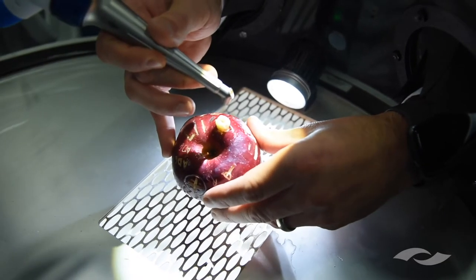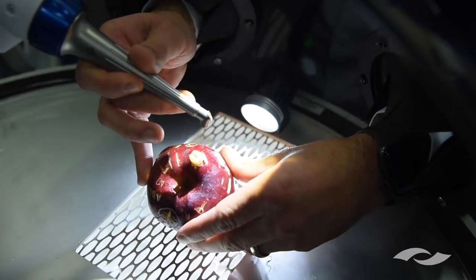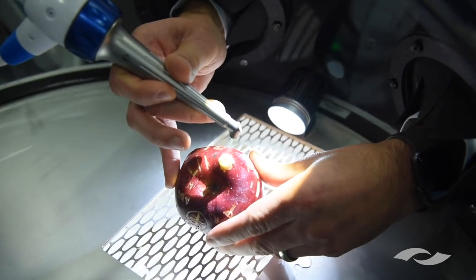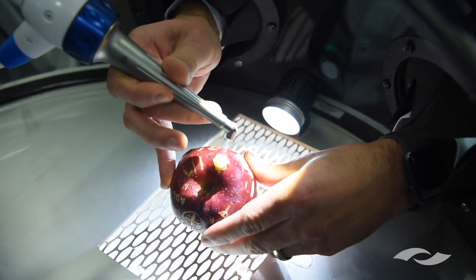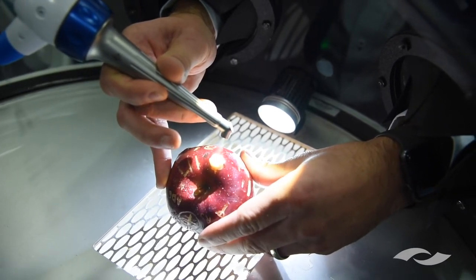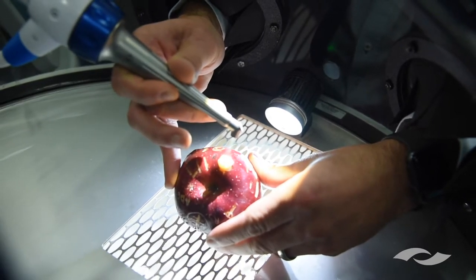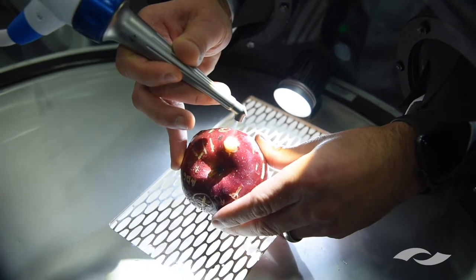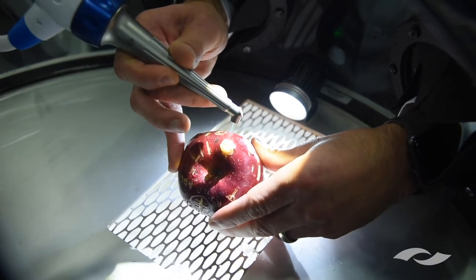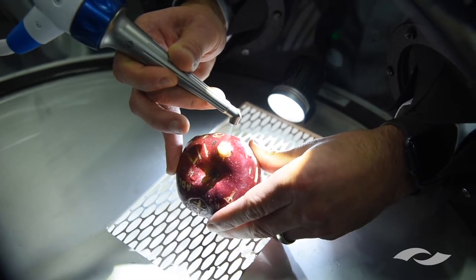When we cut a prep, we approach it a little differently than we do with a bur. We give a little bit of energy and then ramp up. What you'll initially hear is the sound of the enamel being ablated, and what you'll also notice is that bright plume — that is the ablation of the enamel as it cuts. You'll notice that I move very slowly as I'm ablating this tissue. It's not a back-and-forth painting motion; you have to give time to allow the tissues to respond to the energy you're giving.